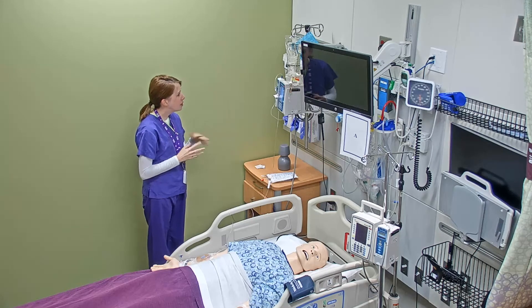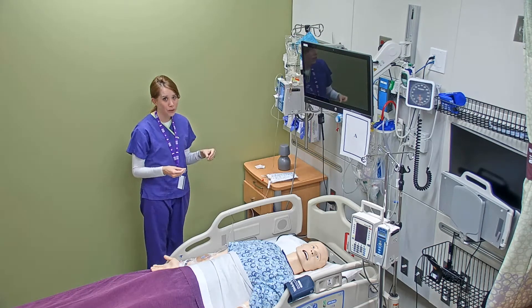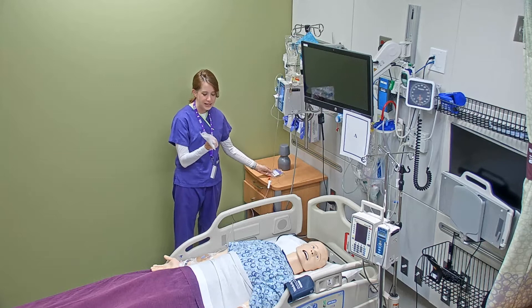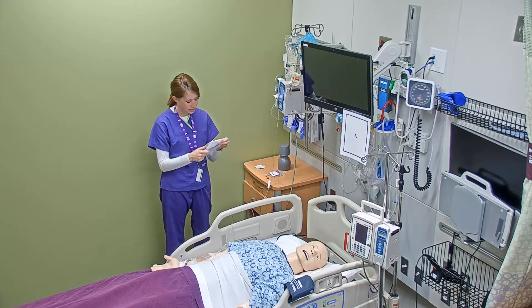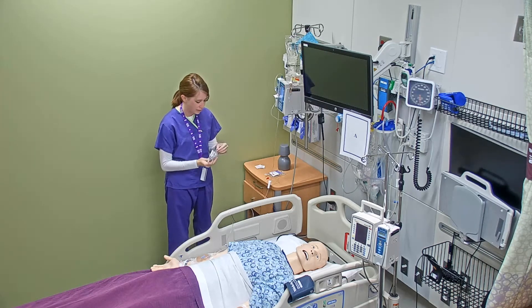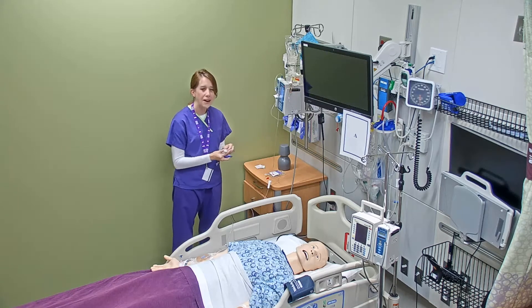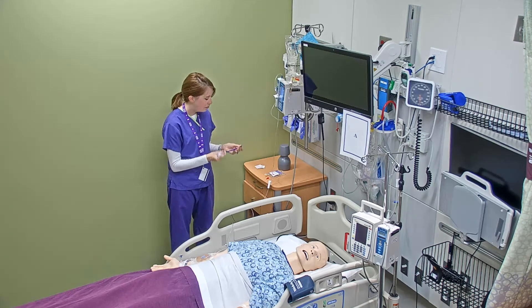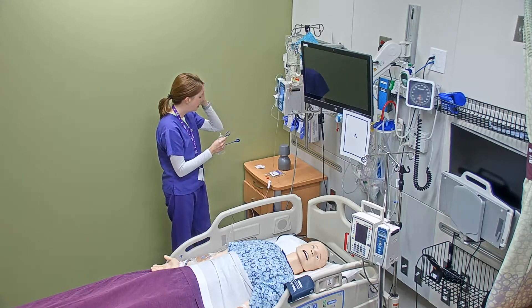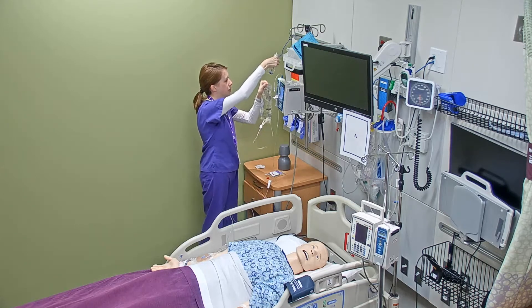My pump is already running with a primary line and I really don't need to touch that line for several more minutes. Instead, I'm going to take my secondary bag — this is a set of brand new secondary tubing. This tubing does have a perforated edge so you can get into it. You'll remember from your foundations lab class that you were taught how to backward prime an IV, which means using the fluid from the primary IV bag to get the air out of this secondary tubing.